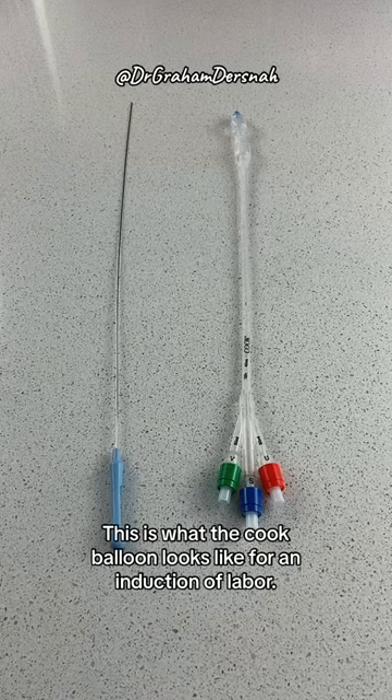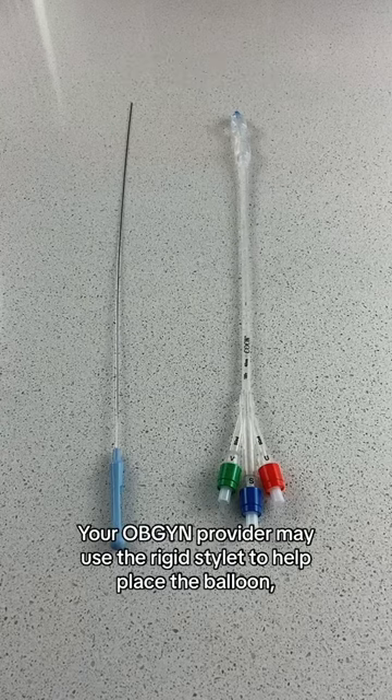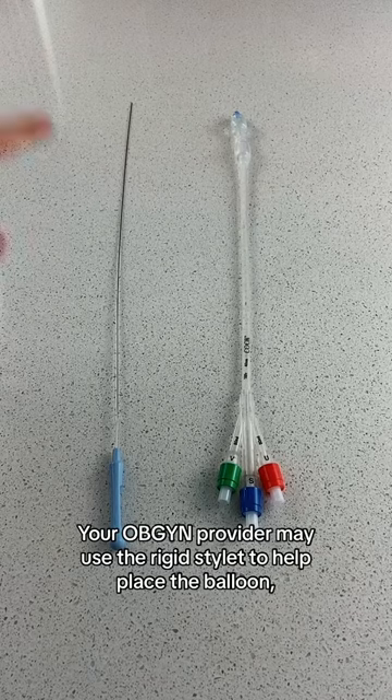This is what the Cook balloon looks like for an induction of labor. Your OB-GYN provider may use the rigid stylet to help place the balloon, then it's removed.